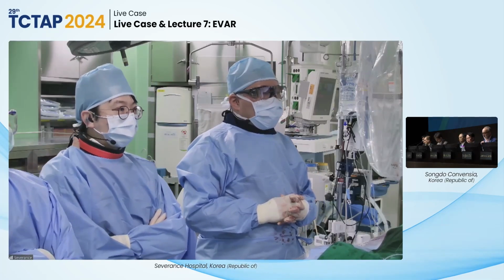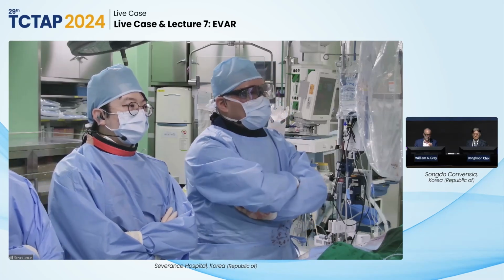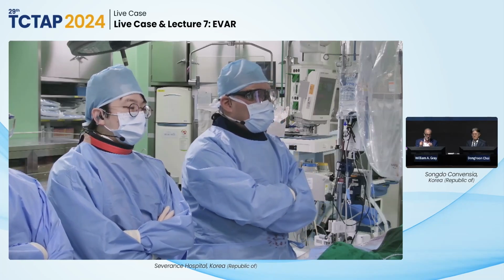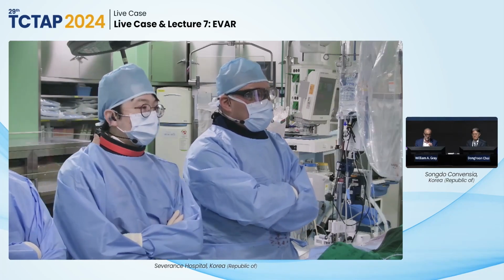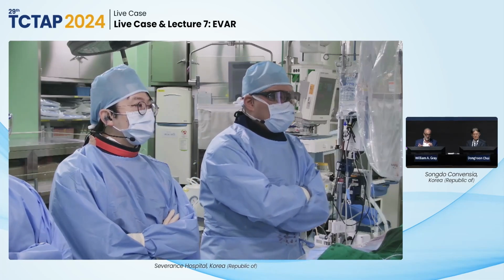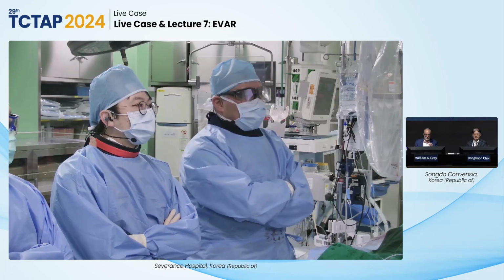No, it's very nice. I just want to make a comment to the audience who may not be familiar with the embolization technique. You did a nice job of keeping the embolization plug proximal in the vessel. If you go too distal, then you cut off many important collaterals from the contralateral internal iliac, and you've basically canceled your effect of maintaining patency over there. So that was a nice job.